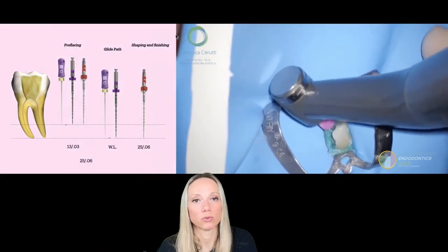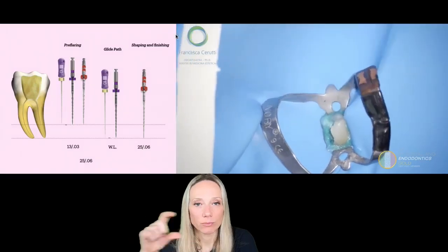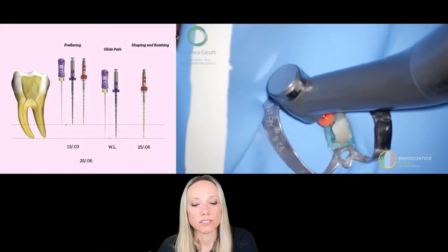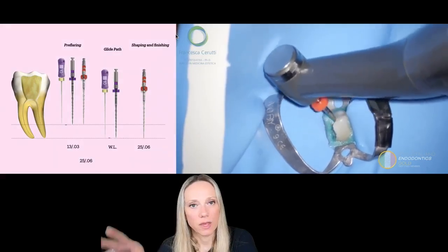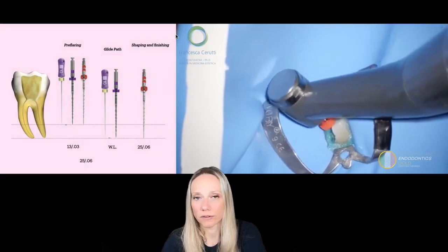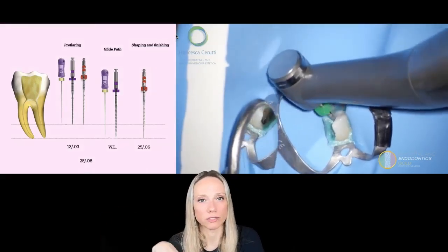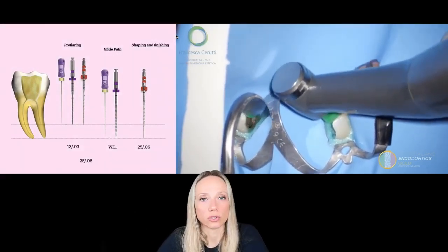Because I don't need to brush, because I don't want to remove dentine in the pericervical area. And then I use my 2506. You see that the 2506 here goes smoothly to the apex. If I had encountered some difficulty, I would have not forced the 2506. I would have taken my 2004, taken it to the working length, and then I would have taken my 2506. So it's up to you guys to decide what you are going to do.